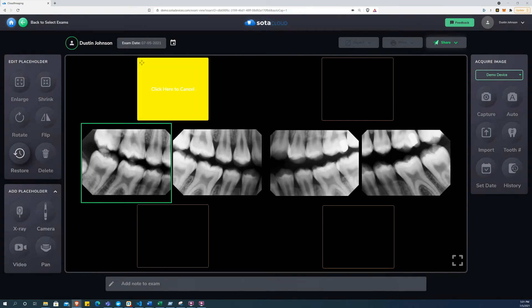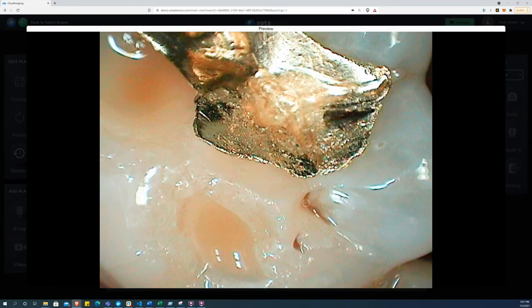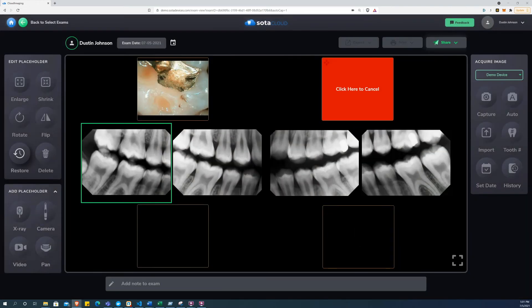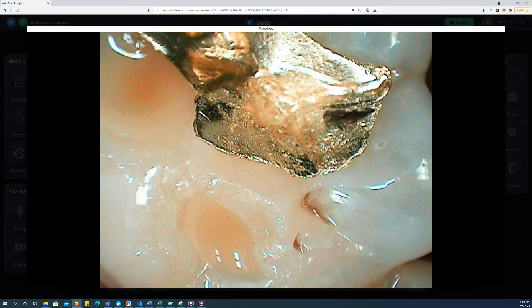As soon as the image appears in the placeholder in the exam view, the image is uploaded. That's it. No need for separate upload procedures. All of the images that you can see in the exam are already safely stored in the cloud.